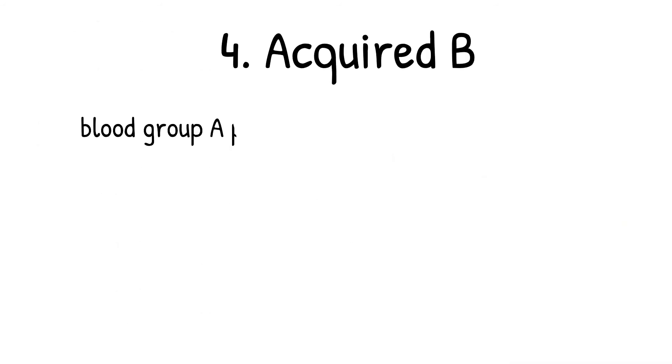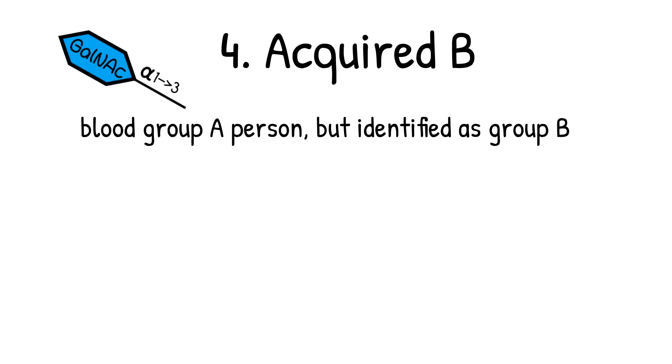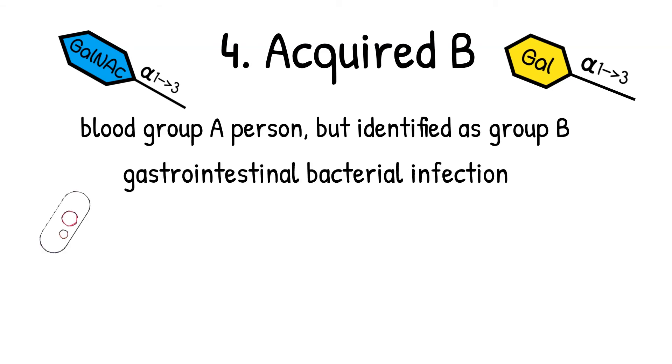Fourth, acquired B. Oh, this is a fun topic. An acquired B phenotype is when an individual is actually group A, more specifically group A1, and currently typed as B blood type. This happened in patients with gastrointestinal bacterial infections.